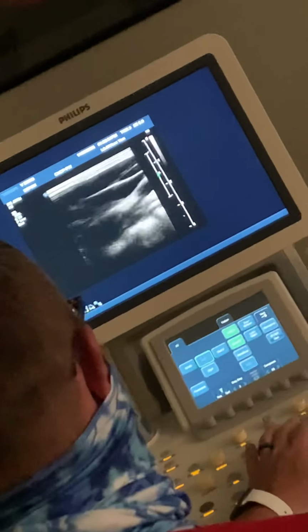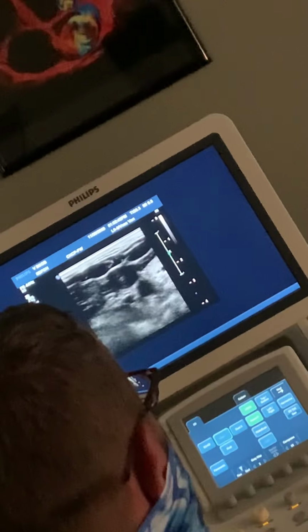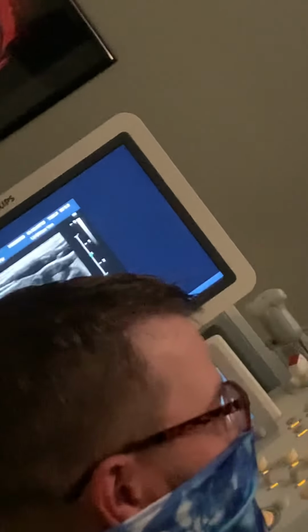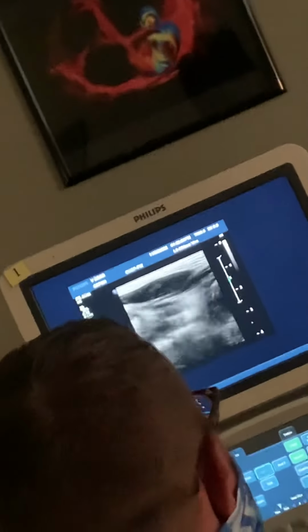So, all right. Now, what I like to do from here is follow this down. Now, you asked about the reference marker. I still have the reference marker facing me. So it's technically backwards. It's not the patient's right. It's because I'm on this side. I can turn it away from me if you want, but the honest answer is it doesn't matter.